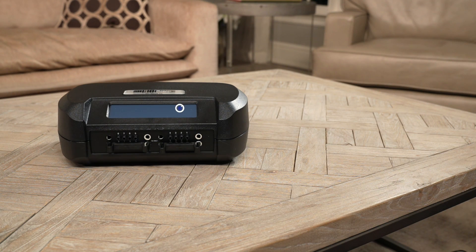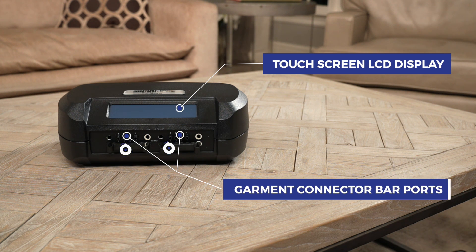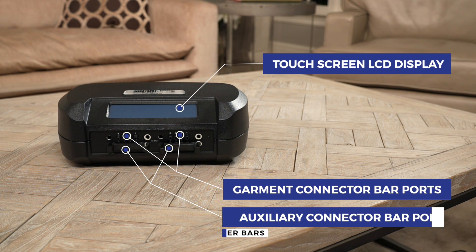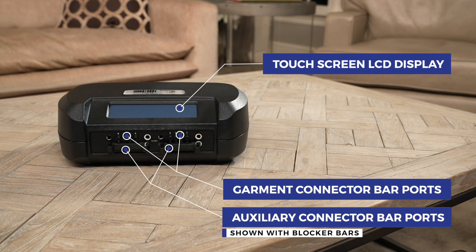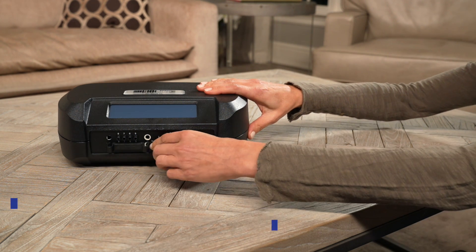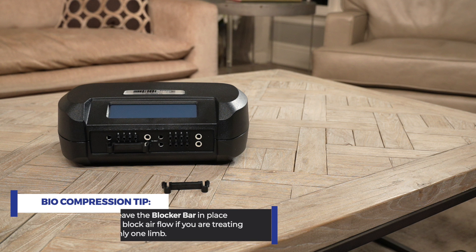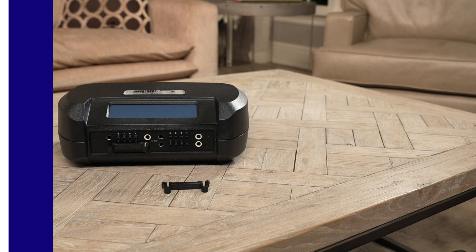This sequential circulator has a touch screen LCD display, garment connector bar ports, and auxiliary connector bar ports shown with blocker bars. Leave the blocker bar in place to block airflow if you are treating only one limb. If you are treating two limbs, you won't need the blocker bar, but you should store it safely for future use.